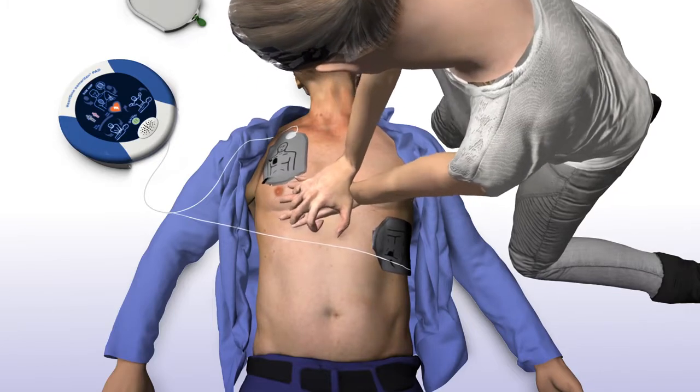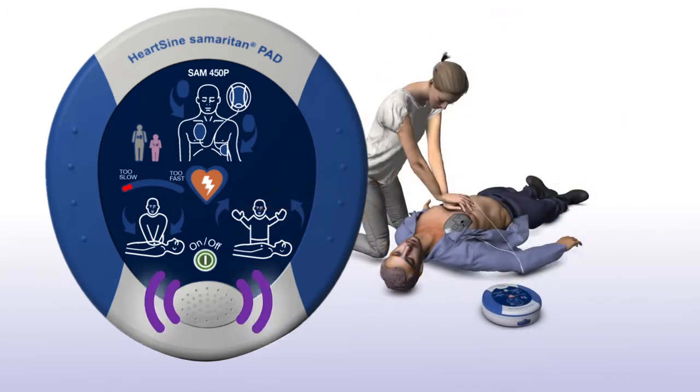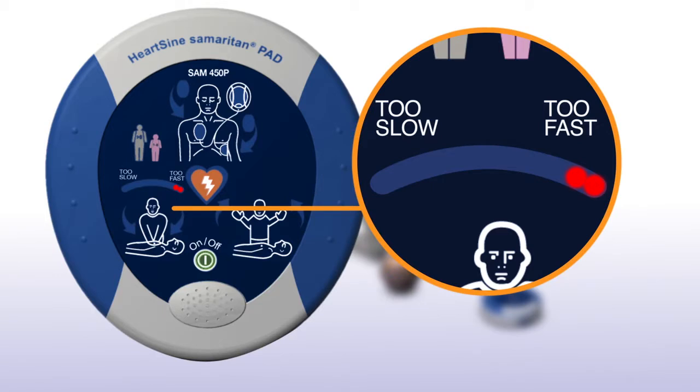Remain calm. If you are performing chest compressions at a rate that is slower than the current guidelines, the SAM 450P will prompt you to increase the rate of chest compressions — Push faster. If you are performing chest compressions at a rate that is faster than the current guidelines, the SAM 450P will prompt you to decrease the rate — Push slower. When your rate is within the recommended range, the SAM 450P will reassure you that you are providing an optimal compression rate.